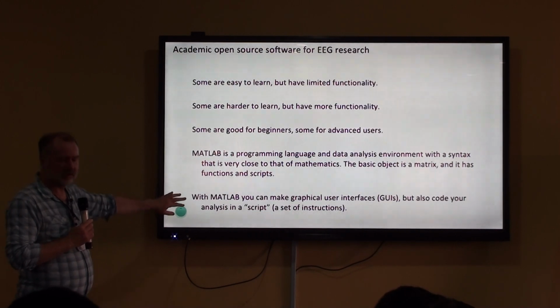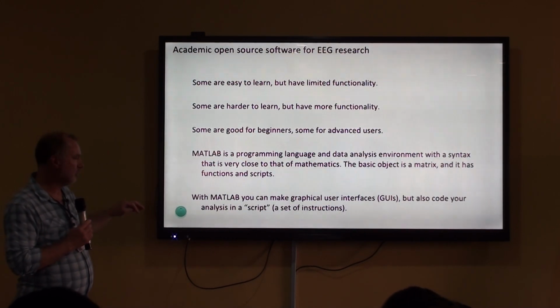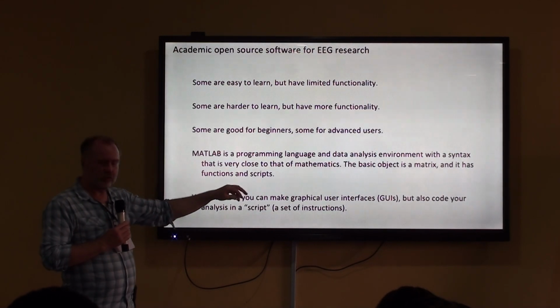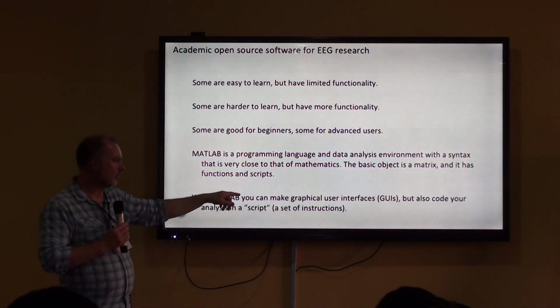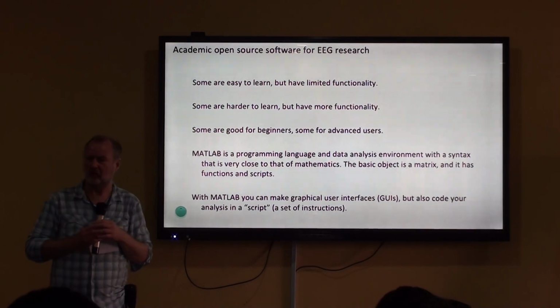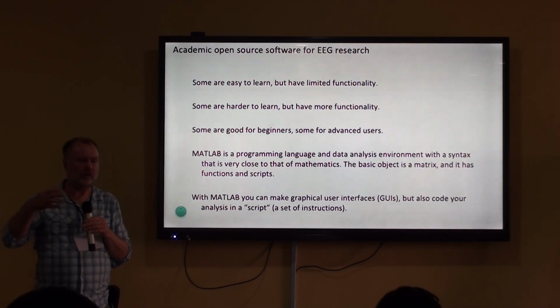And as I said, some of the software packages have graphical user interfaces. Some of them, like Brainstorm, use the graphical interface as well. So you can also do your analysis this way. It's also possible to set instructions, so we'll actually use the scripts for that.